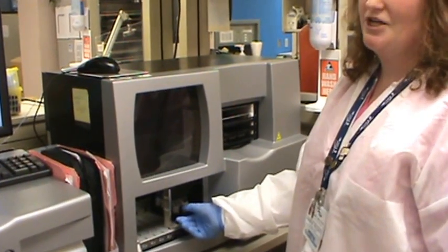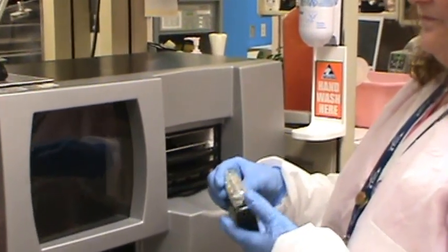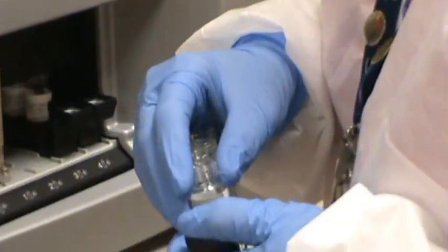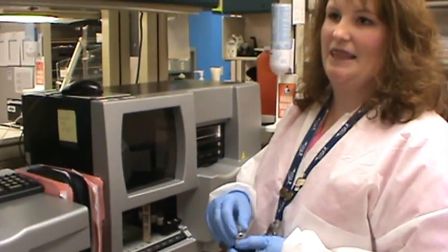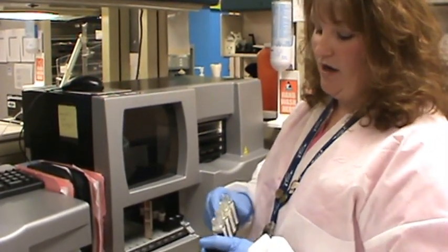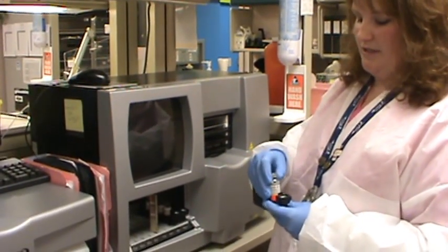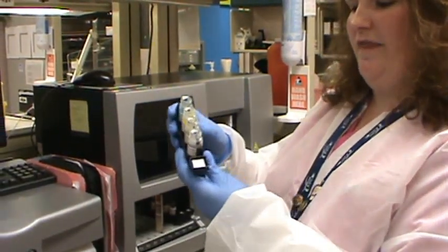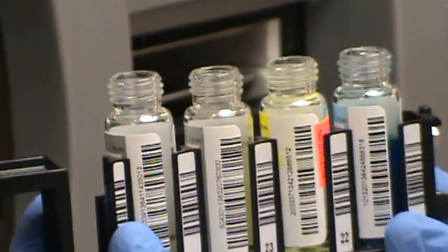Your barcodes for your reagents will include your lot number and your expiration, and also the Galileo Echo is capable of holding onto information as far as how many times the bottle has been on and off the machine and the total amount of time the bottle has been on and off the machine. The racks for the reagents have a symbol on them that resembles a reagent bottle. There are 4 slots on the reagent rack for a total of 16 reagent bottles that can be on the analyzer at any given time.